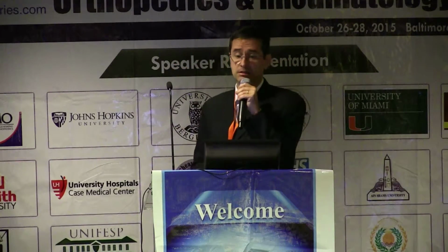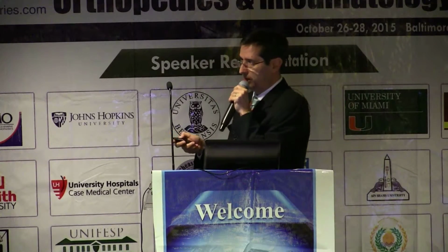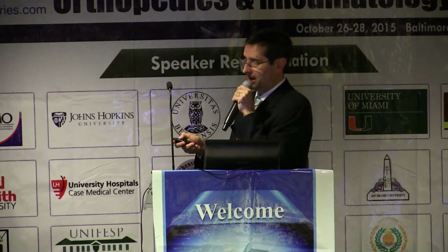In this case, 7 months after the surgery, the patient continues with paresthesia in the thenar region. In ultrasound, in the distal region of the forearm, the palmar cutaneous branch appears with its usual aspect, surrounded by fat tissue.